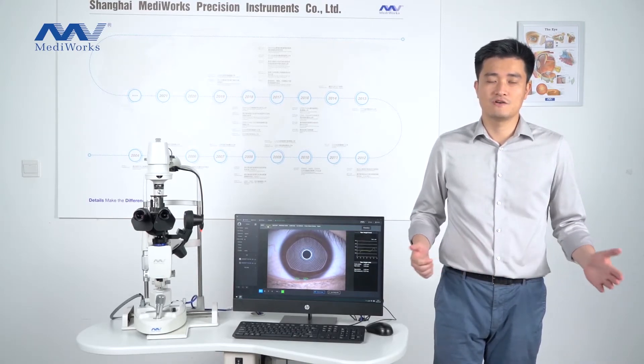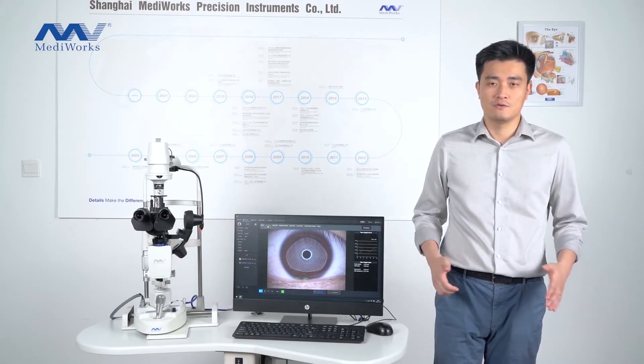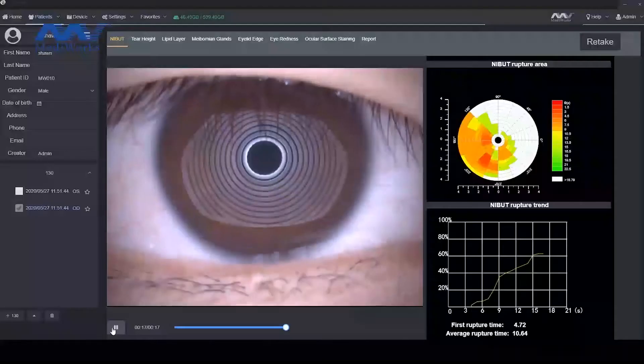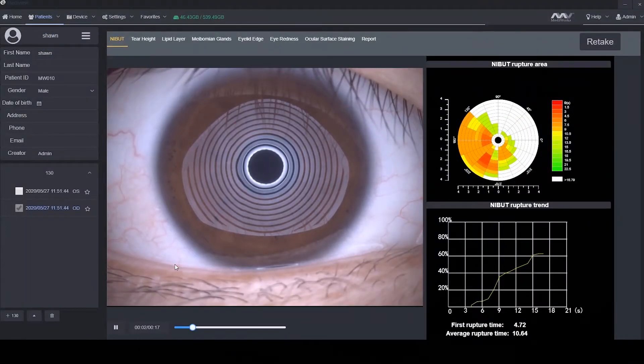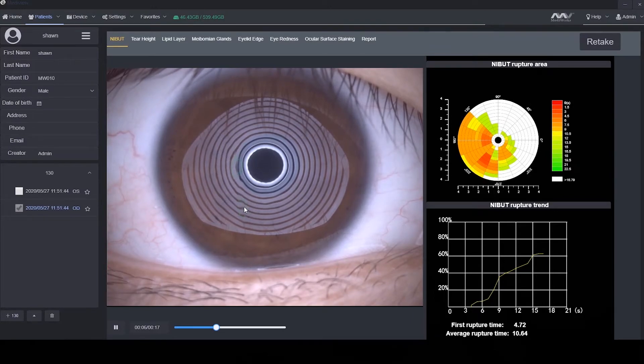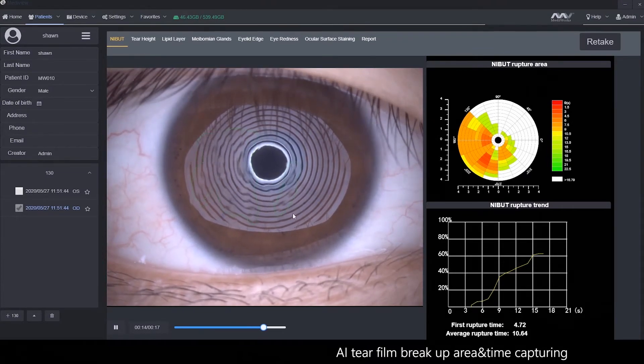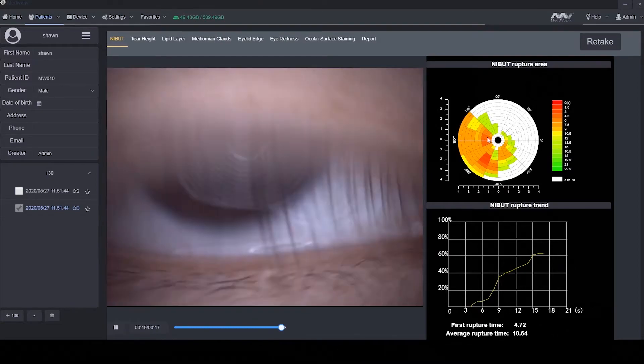We apply a lot of AI technology to make the analysis more accurate and faster. For example, in iBUT, you can see the green circle — we are using AI to capture the tear film break-up time and break-up area.